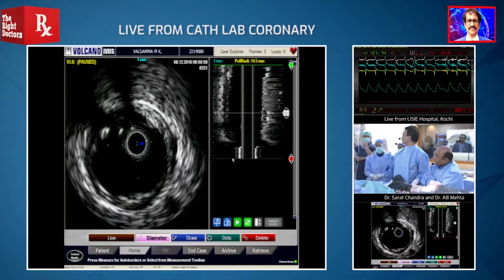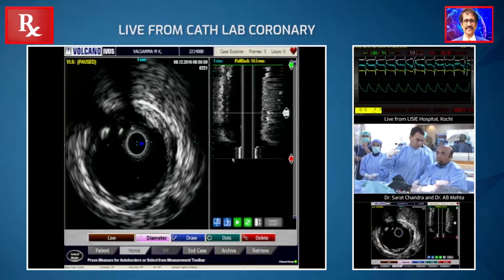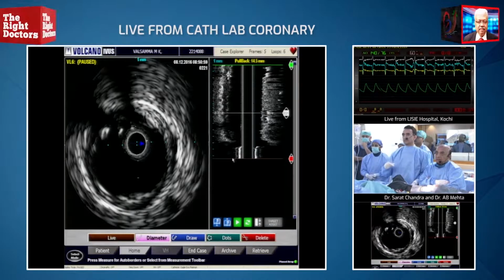Okay. Just one minute. Let's show them what you have done. Okay, keep going. Go to the scene plus.